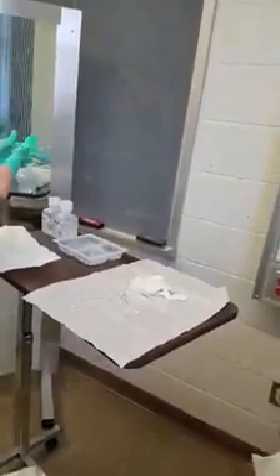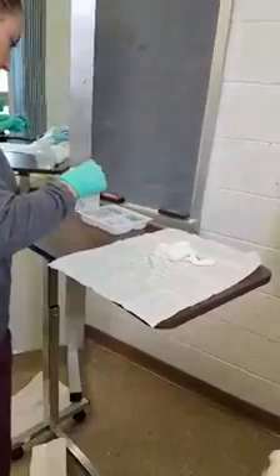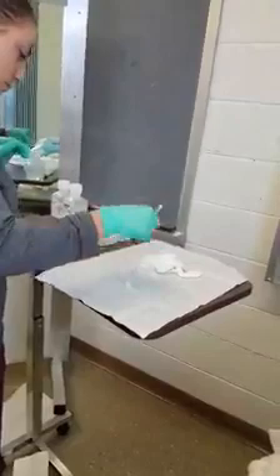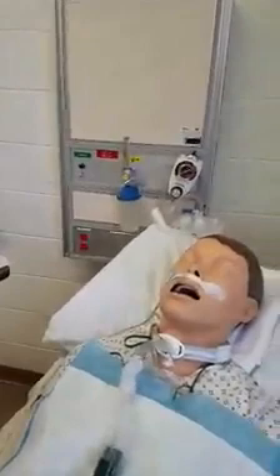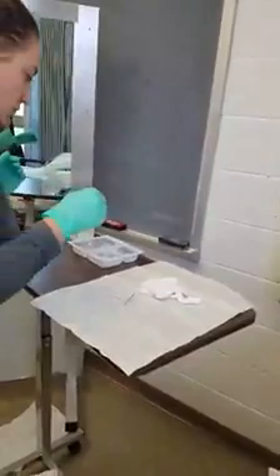She will then remove the inner cannula. Stabilize the cannula with one hand, stabilize the flange with the other hand, place it and soak it in the peroxide solution. She will then inspect and clean the peristomal skin area with Q-tips or gauze dipped in the normal saline solution.